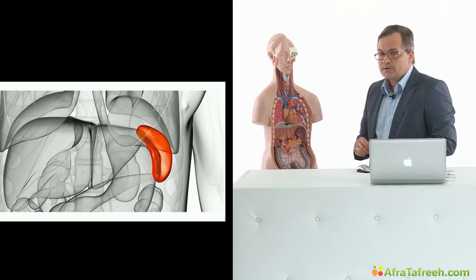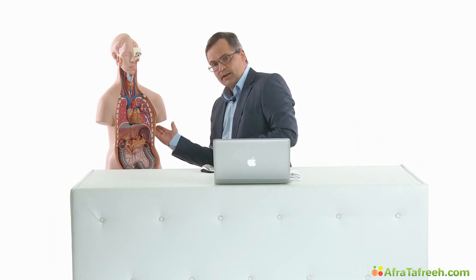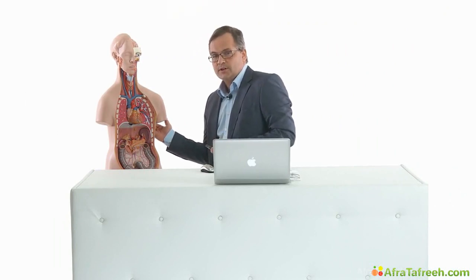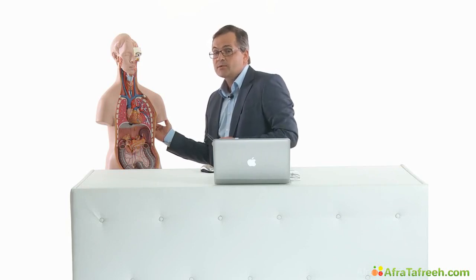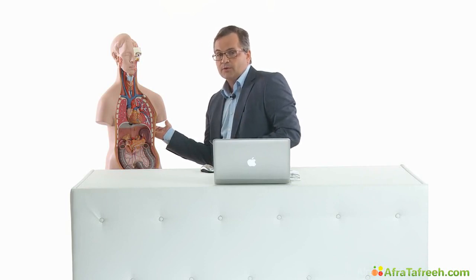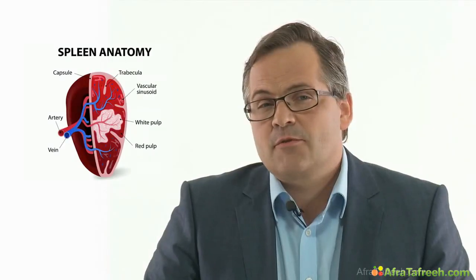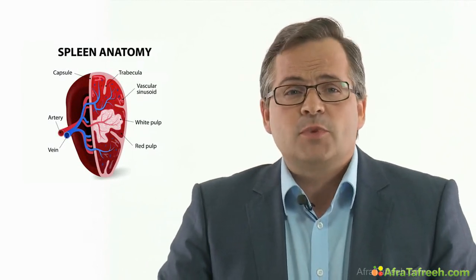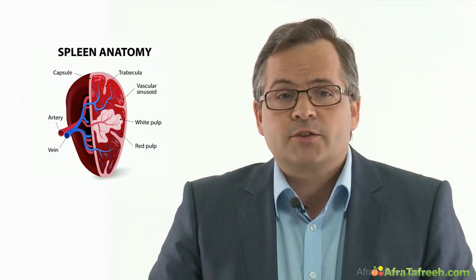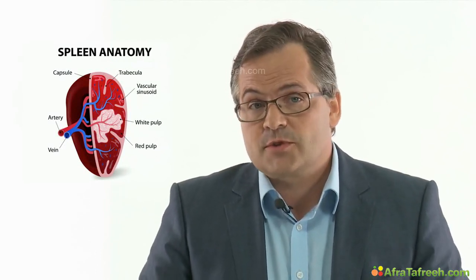So when we perform an ultrasound scan on the spleen, we place the probe in an intercostal space on the left side, glide the transducer anterior and posterior to find the tissue of the spleen. Once we get a glimpse of the spleen, we rotate the probe to enlarge the diameter of the organ on our screen. Maybe we have to tilt the probe a little down or upwards. As with every other organ, we send the ultrasonic beam through all the tissue and find out the size of the organ, its echogenicity, we exclude lesions and observe the surrounding area.